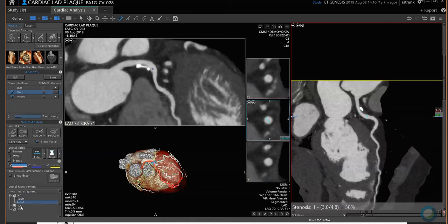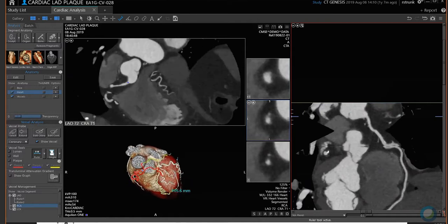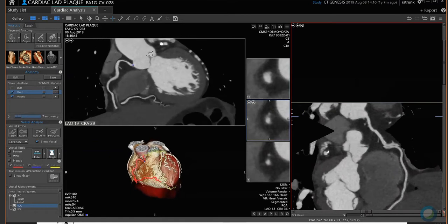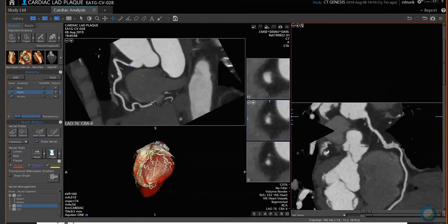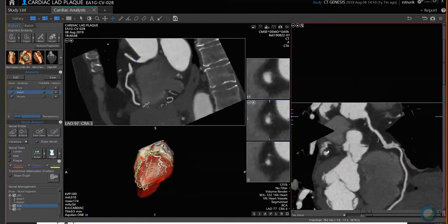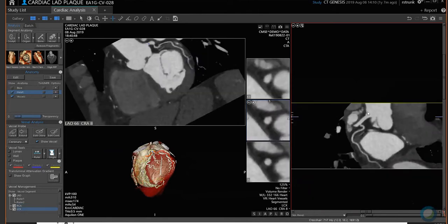If you want to see the right coronary, just click on RCA. Here's your right. You can rotate this so you can see it on the 3D. Top right is undo. You can also rotate it up here — see how turning it opens up these loops. Then you can go to the circumflex and see that it goes down the circumflex as well.